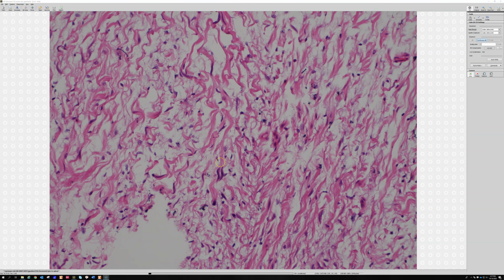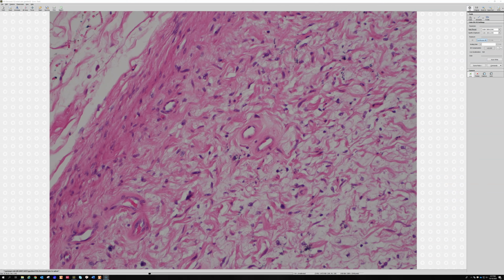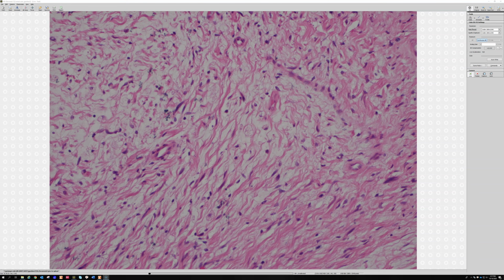They're kind of S-shaped or buckled, bent, crooked. Another Mark Edgar thing that he taught me is that they look like, if you take a can of Coke and you open the can, the little tab on the can is kind of bent. It's kind of crooked. I like that because sometimes they look S-shaped, but I think more often they look bent, like someone pushed their finger in the middle of it and dented it in, or like those little pop tops on the tabs on the can of Coke. And again, one of the many visual clues that Mark taught me, and I thought that was exactly what they look like, right? I was like, oh, that's so perfect. So that's a typical thing of Schwann cells, all right?